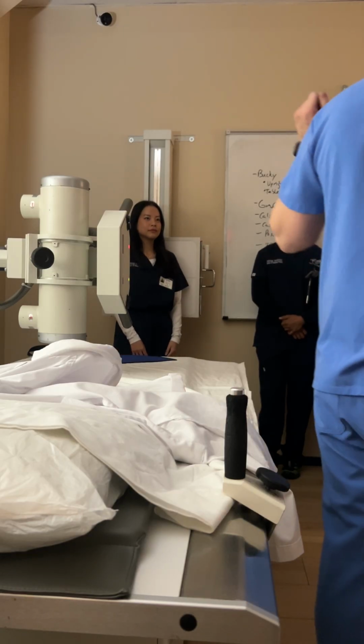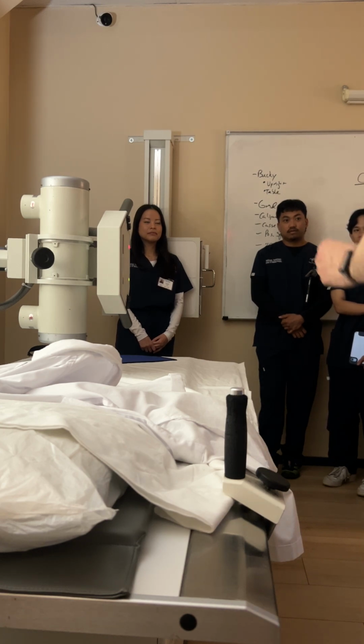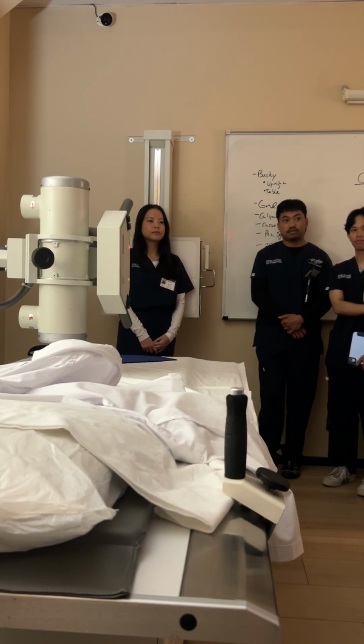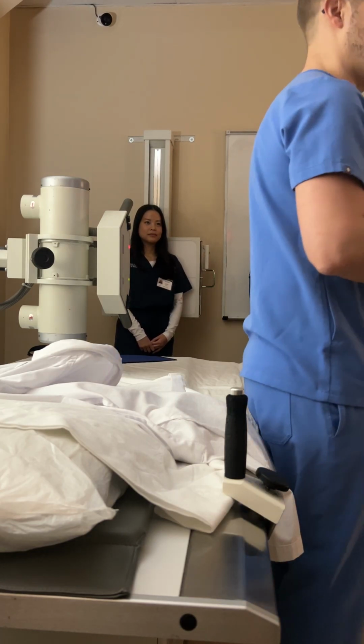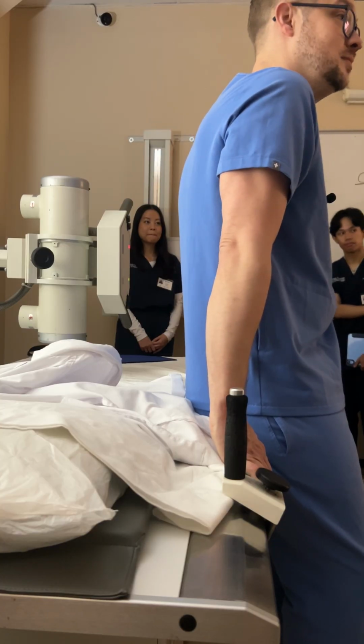Take a deep breath in, blow that breath all the way out. Take another deep breath in, hold it, don't move, don't breathe, and you watch them until they finish going. When they stop moving, bam, X-ray. You can breathe. Okay? Don't forget to tell them to breathe. Because if you do, I kid you not, they will stand there until they're blue in the face and pass out. Okay? Questions? We're giving this behind the console, right?